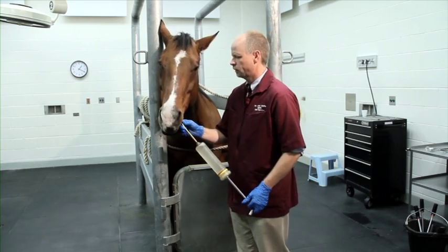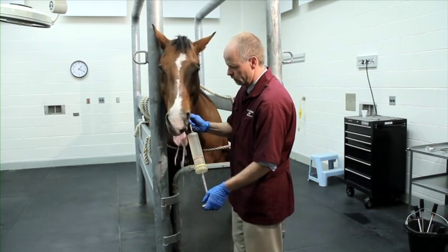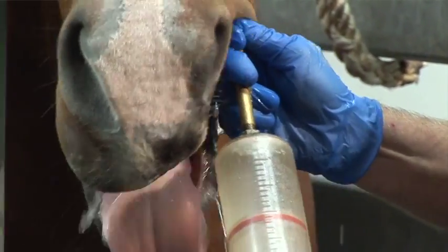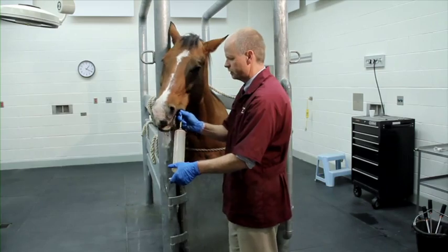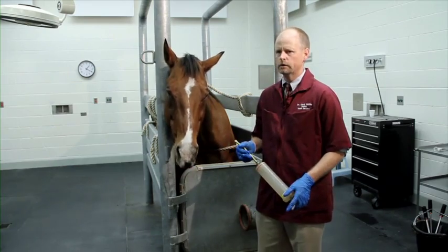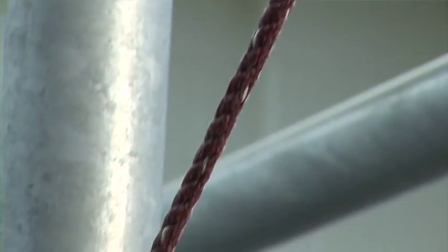Prior to placing the dental speculum and light source in the mouth, it's important to irrigate the feed material out of the oral cavity to improve visualization. We use a dose syringe and a special solution containing chlorhexidine as an oral rinse. This helps with any scratches or irritation during the procedures, keeps our instruments clean, and helps prevent disease transmission between patients. It's been about five minutes since we administered the xylazine — Aggie is very sedate, tranquil, and relaxed.